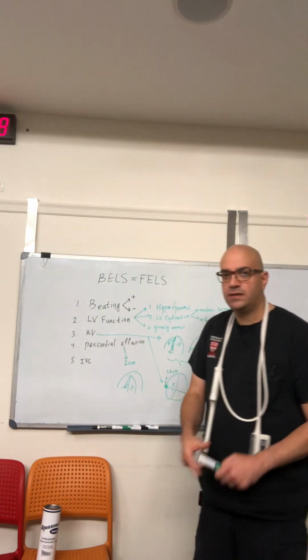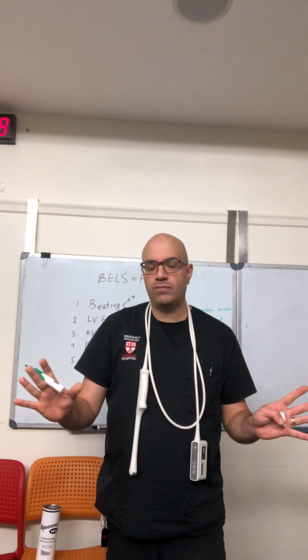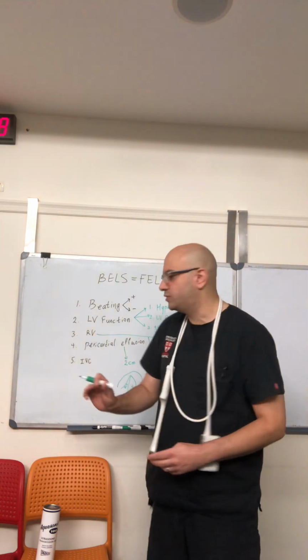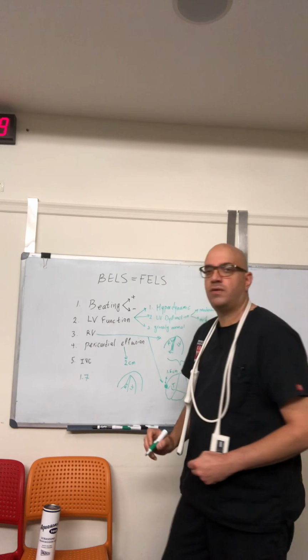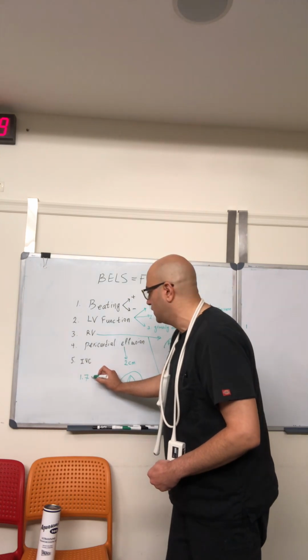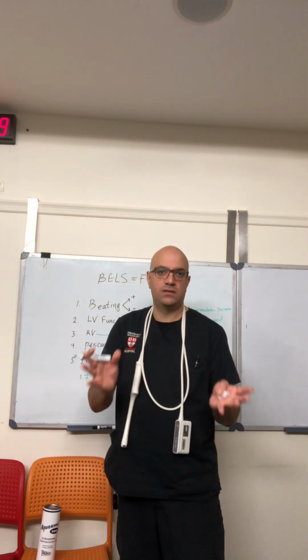How about IVC? There are many talks about it. More than 2 centimeters, more than 1.7 centimeters, more than 1.5 centimeters. The sweet spot I found in most of the talks and most of the literature is 1.5 centimeters. My apologies, 1.7 centimeters. So if IVC is above 1.7 centimeters, it is filled properly or plethoric. If it's below 1.7 centimeters, it's underfilled.